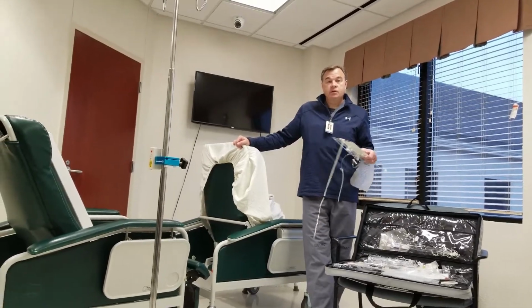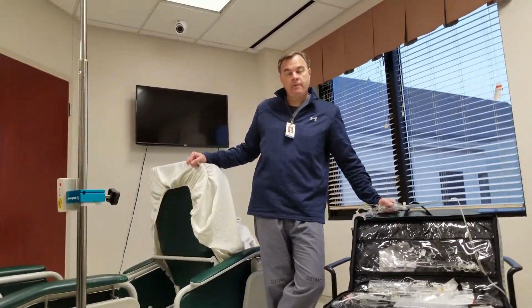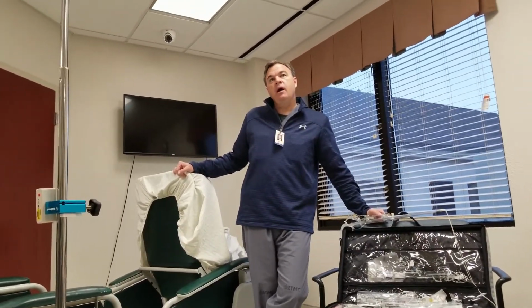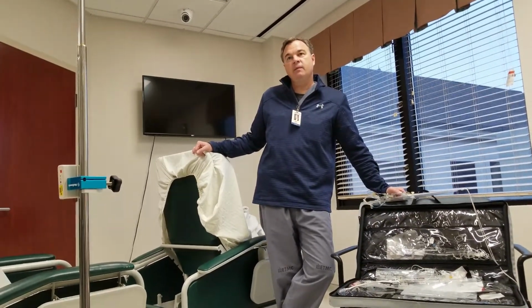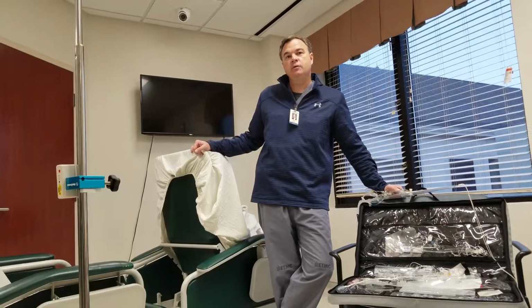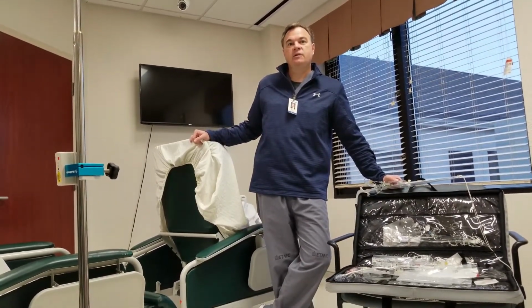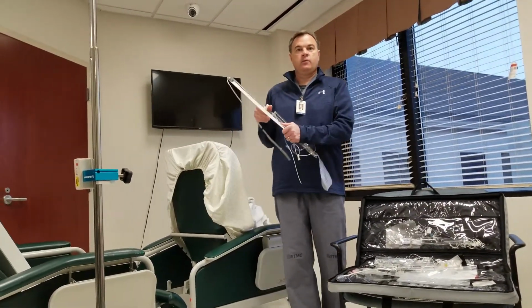I have a question. Sure. I took care of that patient last week, and the order there was that every 1 hour we have to drain 4 to 5 ml. That was a little bit of a curveball. So Matt just wanted to see how much was coming off, to make sure there was enough coming off, because they weren't sure in terms of the volume.